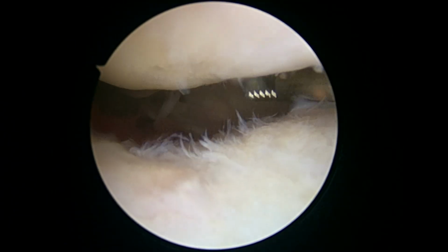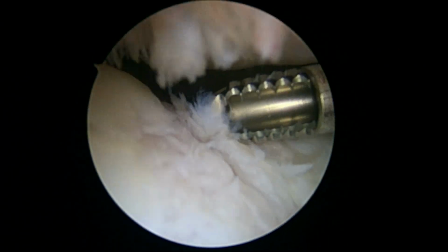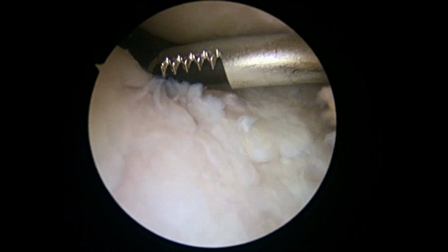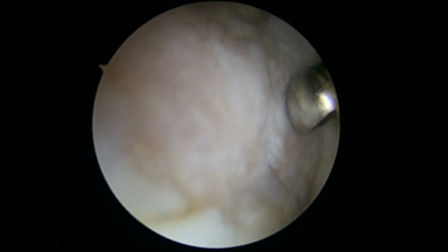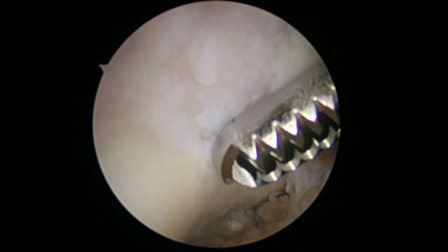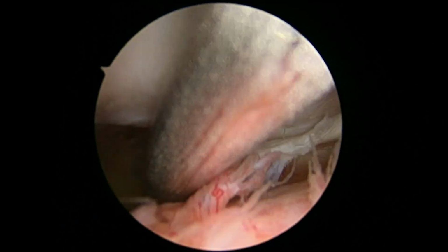We can show you, you've got a lot of arthritis in this patellofemoral joint. Look at this. See how rough that is? And so, again, that's why we're doing our bone marrow concentrate procedure, to try and slow down this progression and minimize your symptoms. But this is likely where these loose pieces are being generated from, all through here.